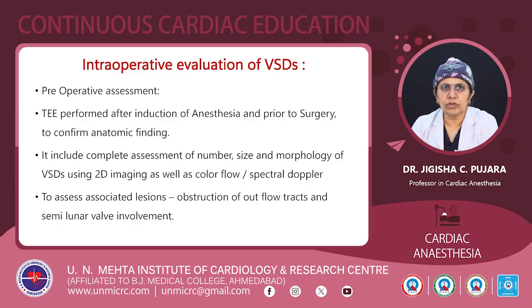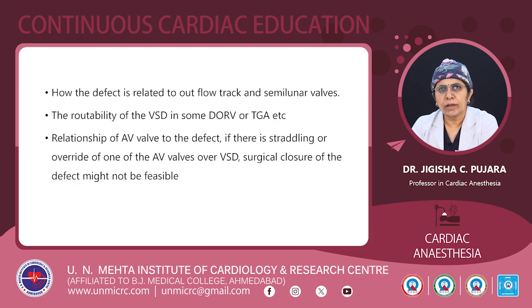One should thoroughly do all the view assessment so as not to miss some valvular regurgitation, mitral or tricuspid, or some aortic valve regurgitation or obstruction, or RVOT obstruction by the muscle bundle. The moderator band is prominent, and there is a divided RV chamber, a DCRV. So one should do a thorough investigation.